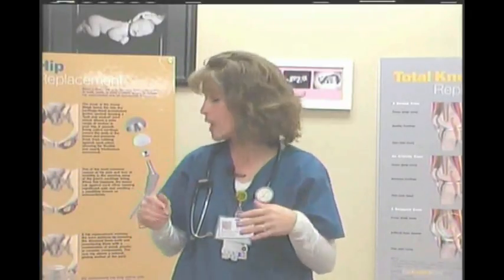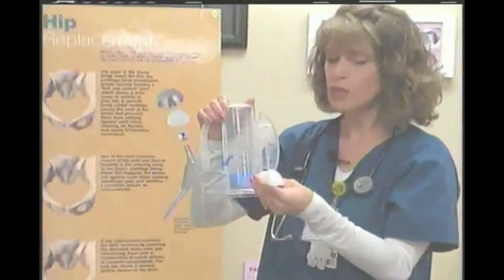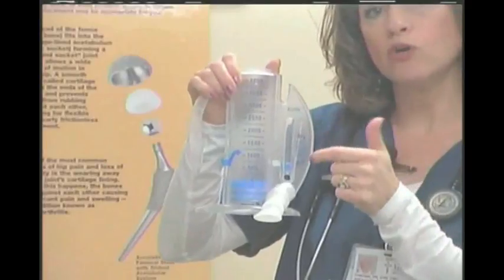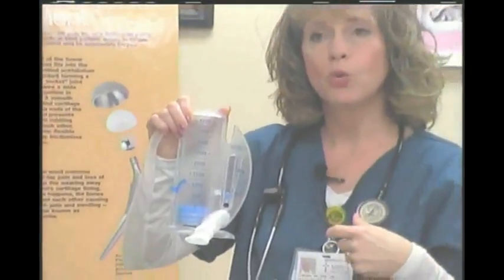Another thing we're going to be looking at on our floor, besides doing our vital signs and looking at your pain, is making sure you're doing well with your deep breathing. We want to prevent any kind of pneumonia issues, so we'll have you do some really good deep breaths and some coughing. We also use, and you may be familiar with this, the incentive spirometer. You suck through the mouthpiece just like you were sucking through a straw, and you keep the blue nugget between the 2 arrows. So it would be a nice gradual intake of breath. This is how you would do it. And then you just relax.